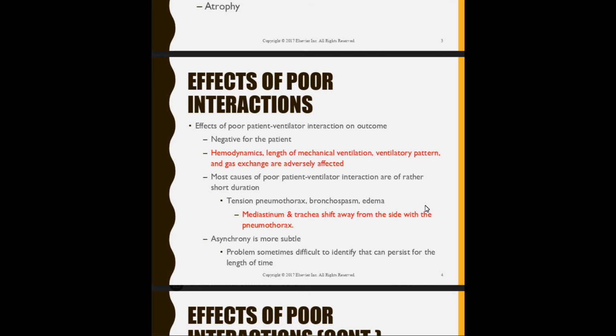And then it says asynchrony is more subtle. I had said it before. Sometimes you stand up, you're going to go answer the alarm, and it stops. All right. And it says it is difficult to identify, that it can persist for the length of time. So, yeah, the length of time may not be as long.